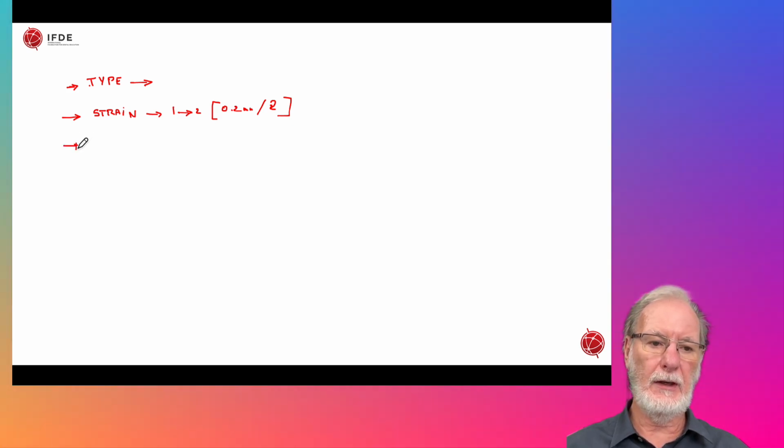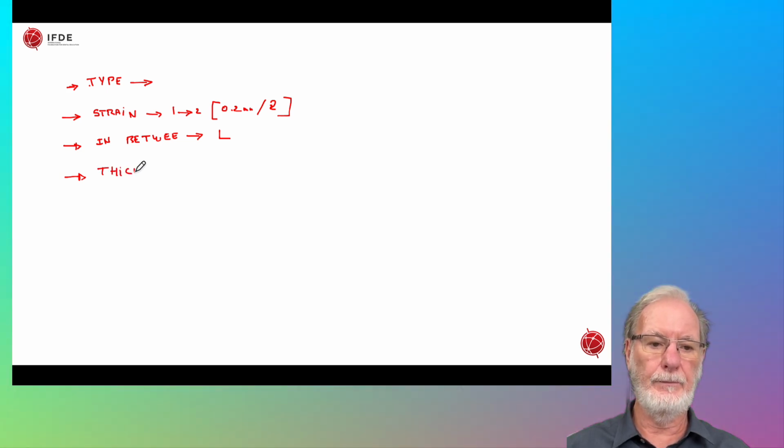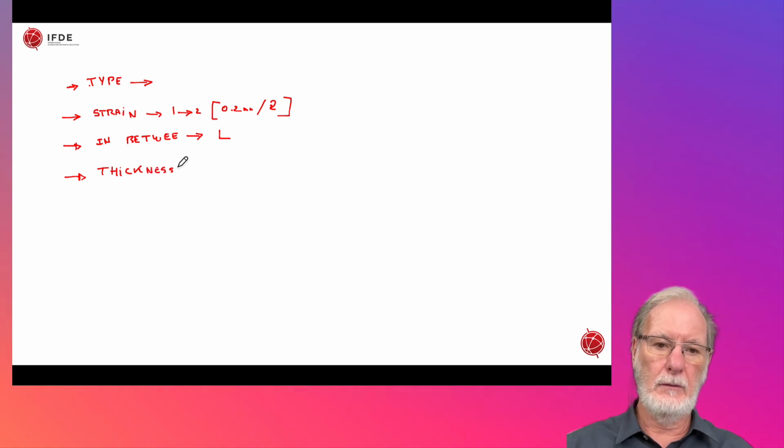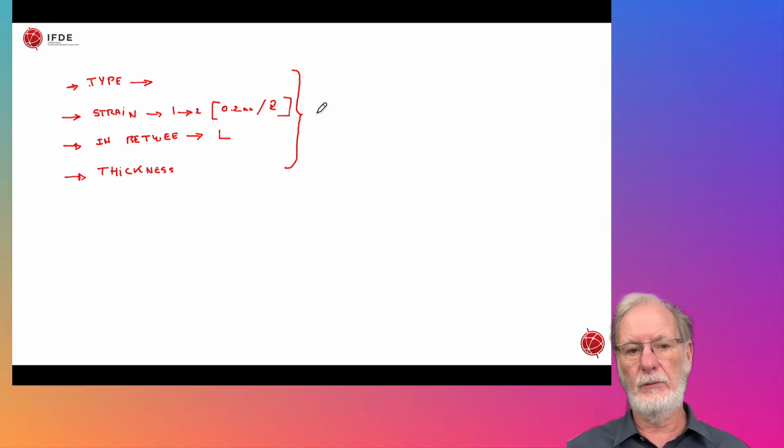You also need to calculate your amount of material in between the active part. So this would be the length, and also the thickness of the material plays a super important role. And when you can get all these into an equation, which is very difficult to calculate because it has to do with tooth anatomy and periodontal support, then you can optimize your software for every single case.